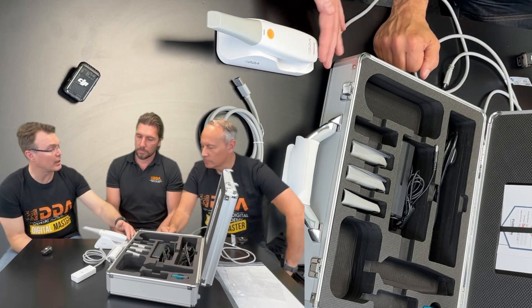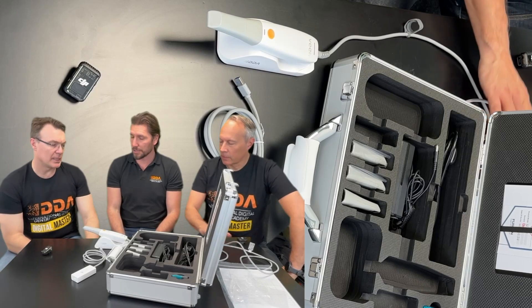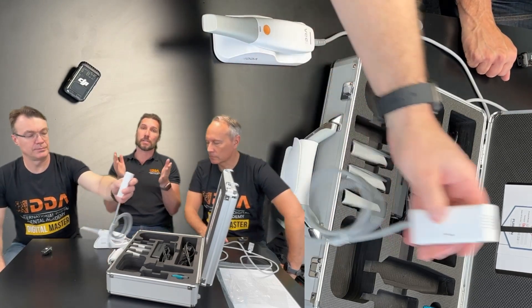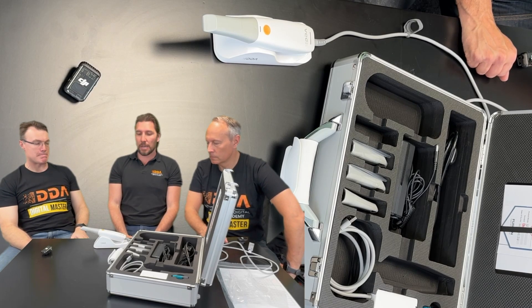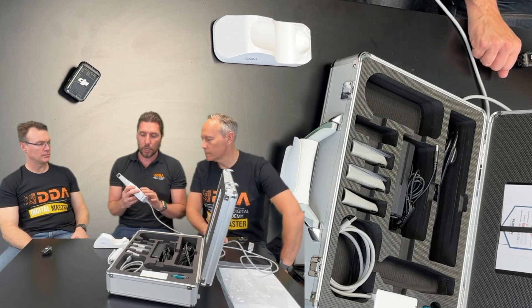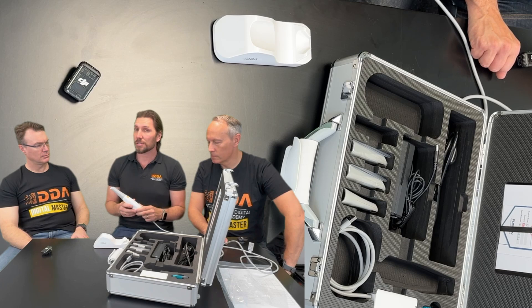If you do have a problem with the cable, it is replaceable. You unscrew the back, take the cable out, and put a new cable in — which will be available on our website. We've worked with other companies that don't have that, and some have a lot of problems with cabling. This is a big improvement. This is a cost-friendly intro scanner for anyone wanting to digitize their workflow, and we made sure we were working with a company that would have good build quality. It is really beautifully made — very solid, a solid piece of equipment. The finish is good, everything is really well-seamed.